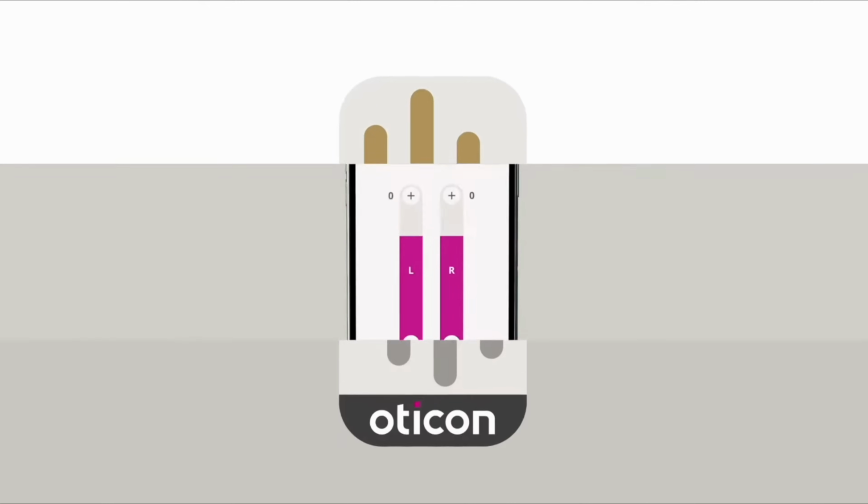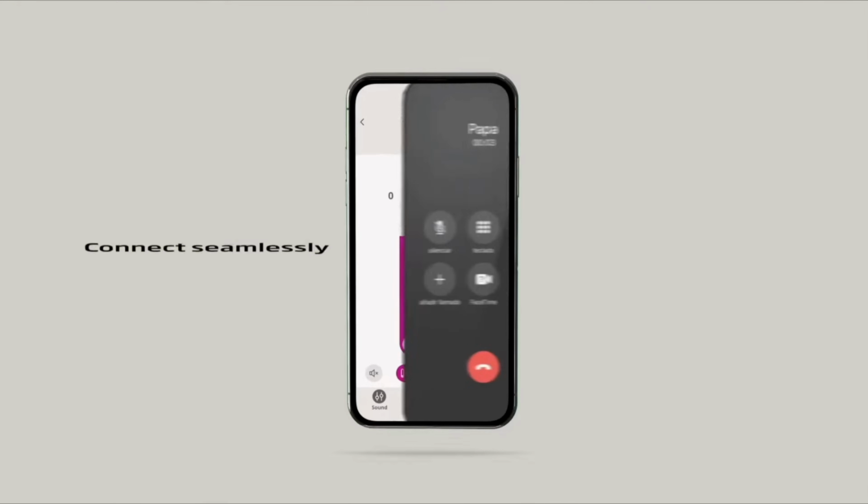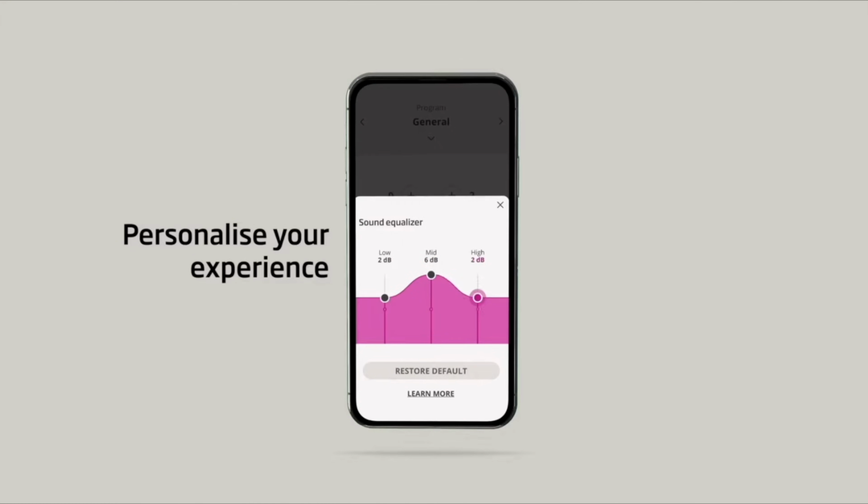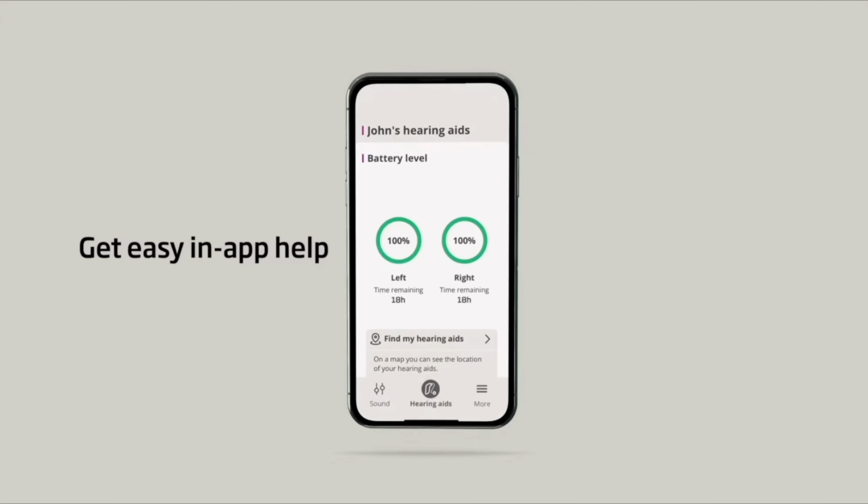Along with the continual improvements made through firmware updates, the app itself saw some major changes this year. Previously, the Oticon On app was used to make adjustments to volume and program changes, while you needed a completely separate app for things like remote care visits. With the new release of the Oticon Companion app, hearing aid controls and virtual visits were combined into one interface, which I find much easier to keep track of.